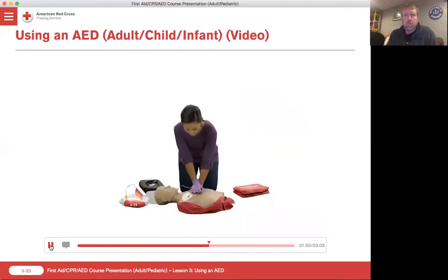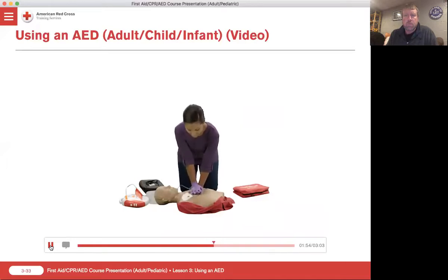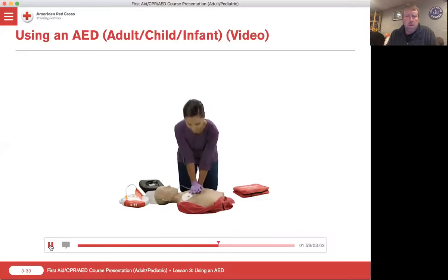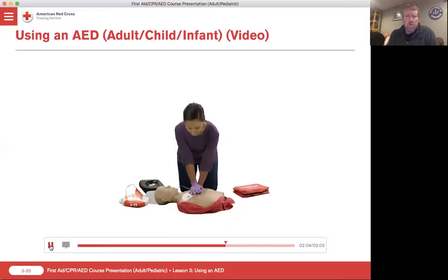After the AED delivers the shock, or if no shock is advised, immediately begin CPR starting with compressions. Continue giving CPR and following the AED's prompts until you see an obvious sign of life or EMS personnel arrive.